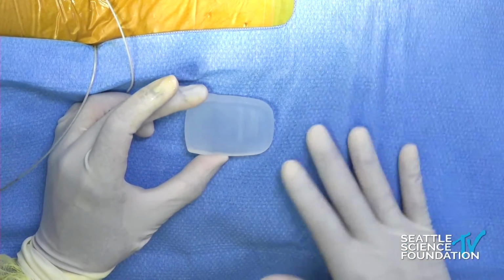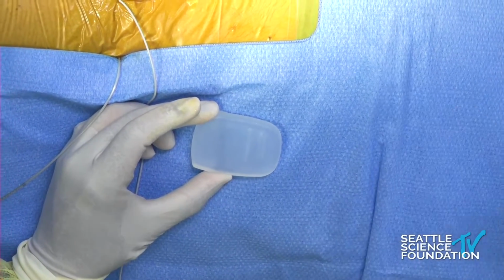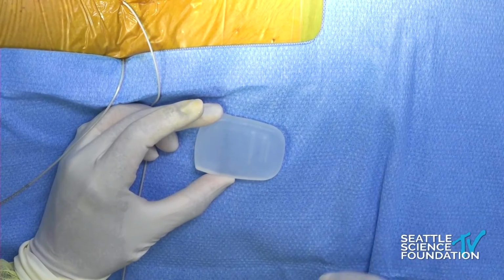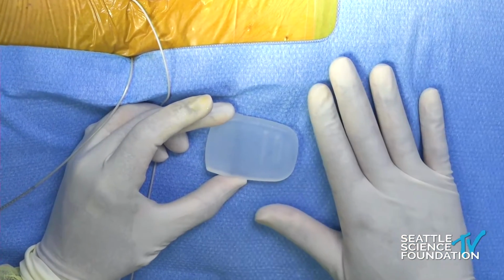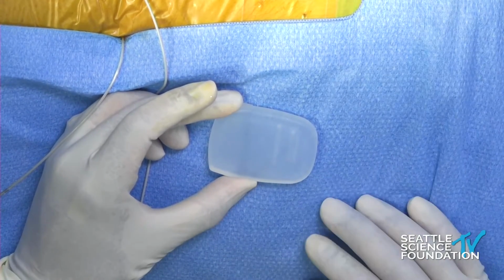So in general, you can go in the buttocks or flank or even abdomen in certain situations. Like if you have a wheelchair-bound patient who has severe pain, spinal cord injury, you may choose to go into the abdomen because obviously you don't want to create a decubitus ulcer on their back, flank, or buttock.